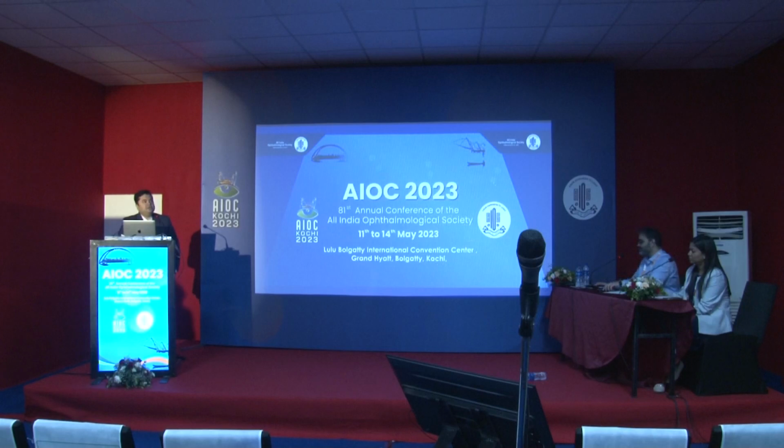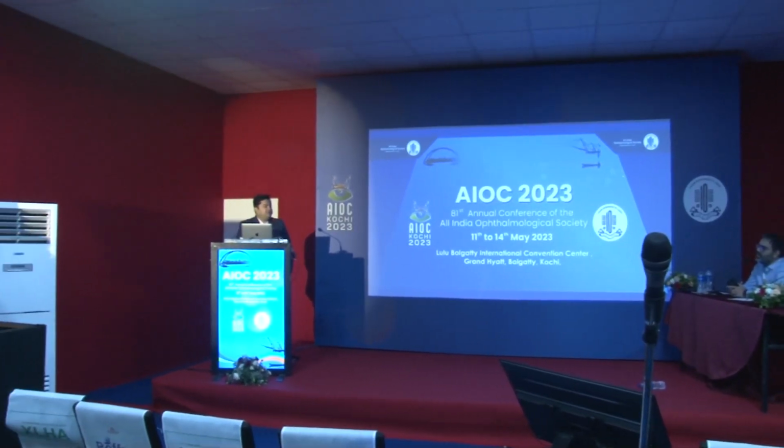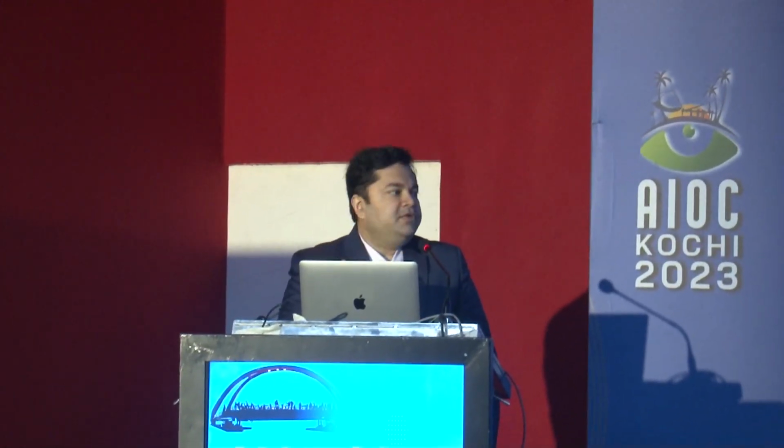Yeah, especially say a young patient post trauma, and you have a subretinal band which is traversing through the fovea. Okay, and you have access to it which is away from the fovea, away from the arcades, and you know that the band is also contracted, it is not going to allow the retina to settle down. So those are the cases where I'll go and remove the band. If I have a peripheral band, and I can manage with the buckle, I'll not do a vitrectomy for such individuals, especially post trauma dialysis. You may not go ahead with the vitrectomy, and the bands can remain there. Okay, and if it's not causing traction, the retina can settle.